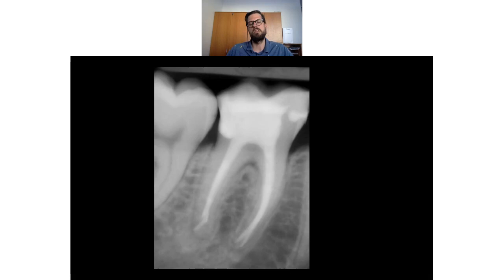And the problem is that I did this endo and I wanted to see the patient after 6 months to check it. So I did the x-ray and I saw that there is a problem with the filling, and I asked the patient, is this it, or will the filling be made afterwards? And he said no, my doctor told me that this is it, so this is the end product. And we see that here is a problem. There is a contact, okay, but not a good contact, because the tooth should have the contact in a different place. So this is the right position or the right shape of the restoration. And the problem is that we are near the crestal bone, and as the doctor put the wedge inside, the wedge went a little bit up, and this happens.